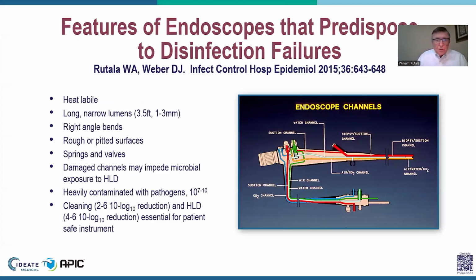We know that there's long, narrow lumens. We know that there is rough or pitted surfaces. We know that there are damaged channels that can impede microbial exposure to the high-level disinfectant. And of course, we know there's a very high microbial load that in many cases will not be eliminated by our traditional cleaning and high-level disinfection.